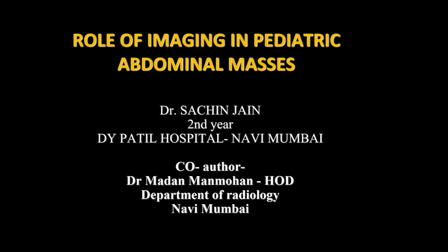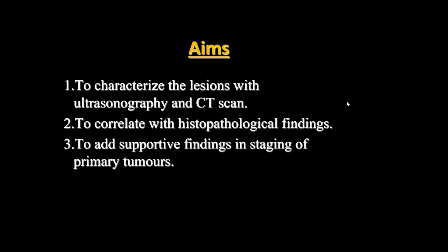My name is Dr. Sachin Jain, and today I'm going to be presenting my paper on the role of imaging in pediatric abdominal masses. The aims of my paper are to characterize the lesion with ultrasonography and correlate it with CT scan, and to confirm the diagnosis with the histopathological findings.